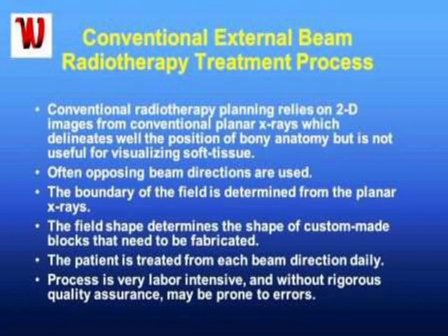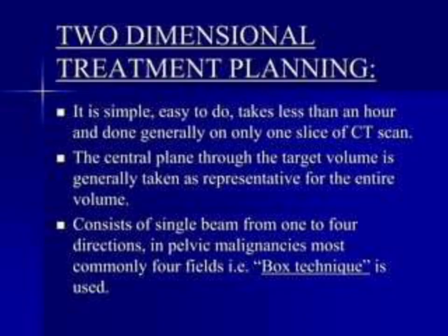Because of a rapid fall of dose after the Dmax, for stopping the scattering of electrons, we put the applicator from the head up to the patient surface where the beam is directed to treat the superficial tumor. The beam flattening filter is not there in the electron mode of the head because we usually get a uniform beam for electron purposes.